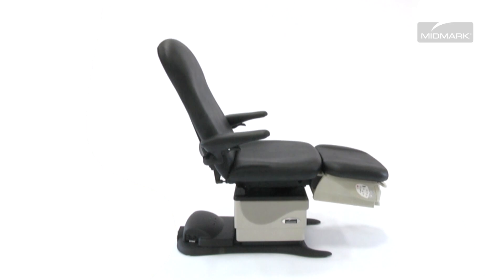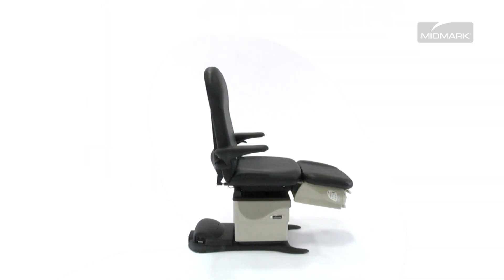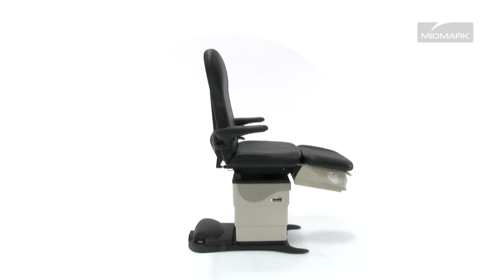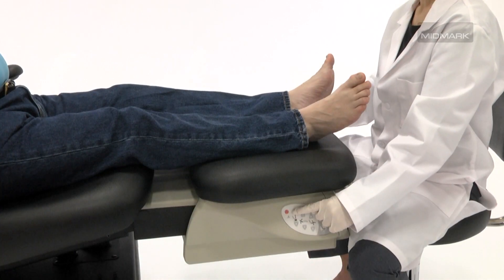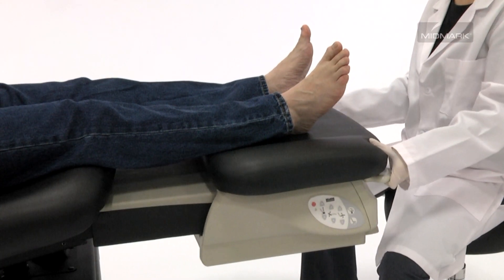Multidirectional positioning also gives you the flexibility to move patients into a working position that's more comfortable for you. The Midmark 647 adjusts in height from 19 to 40 inches from the floor, allowing you to position the chair at a comfortable, neutral working height. And the foot section can be extended up to 9 inches from the chair.